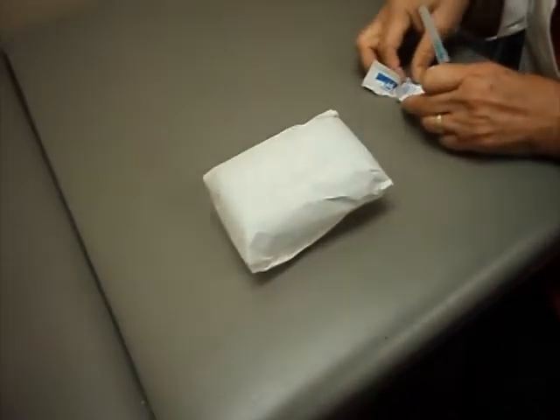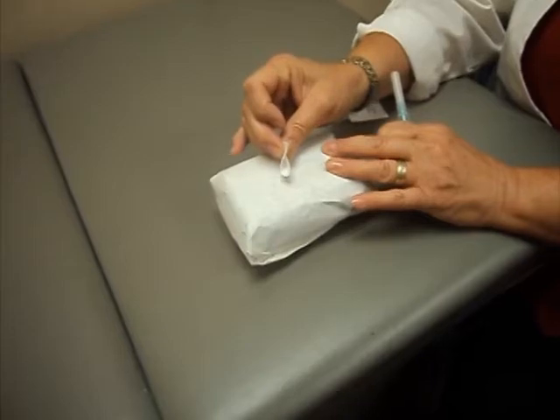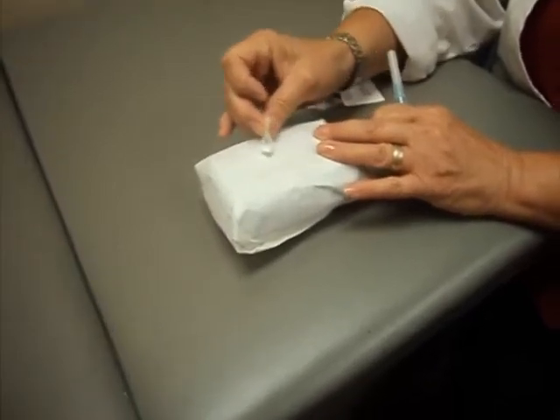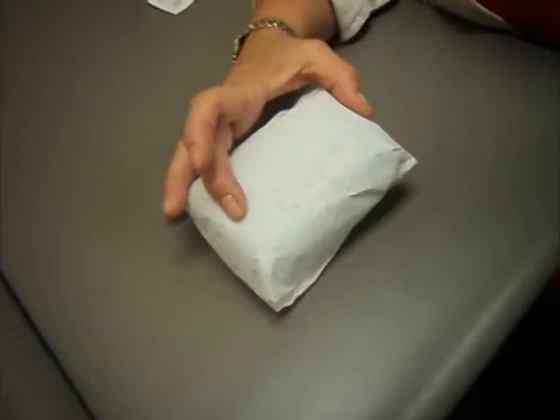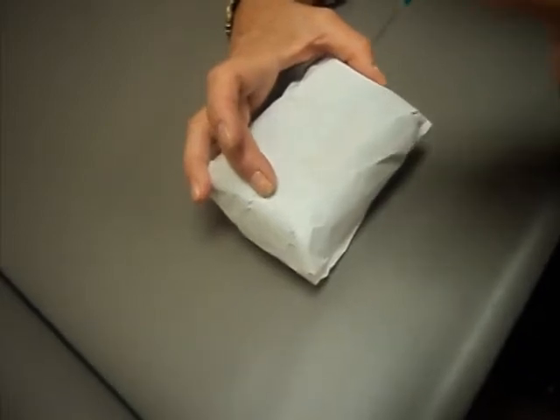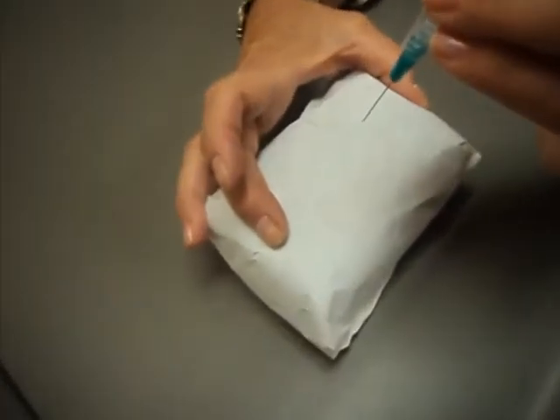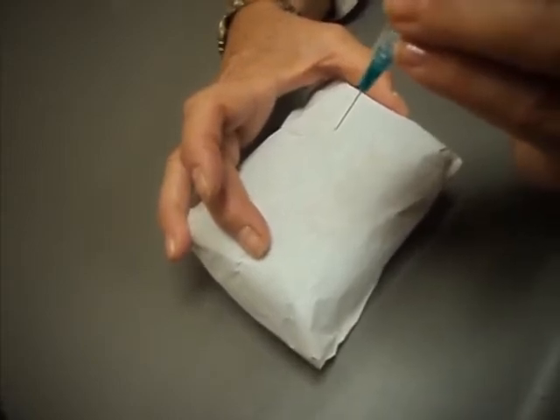Once you've picked your injection site, the next thing we're going to do is clean it with the alcohol prep. You clean from the center moving out, and you want to not touch the site where you're going to give the injection. Holding the syringe like a dart, if you want, you can stabilize the skin between your fingers. Your first finger is going to be on the top. I like to put the needle in not fast, not slow, but evenly, exactly like a dart.